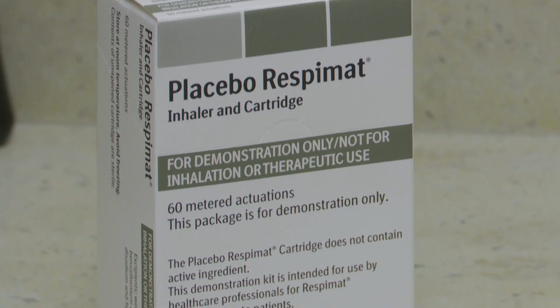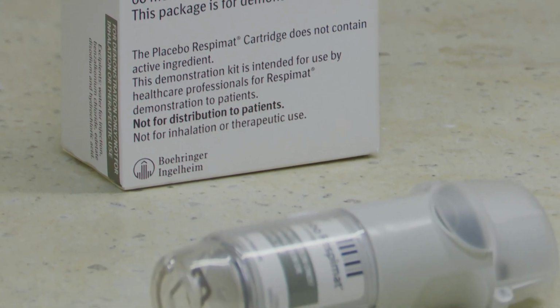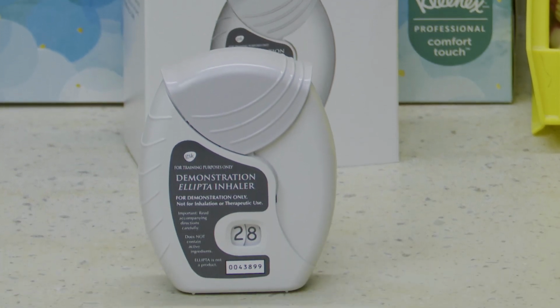The next big mistake Van Klompenburg sees is patients not using the long-term medication frequently. I like to tell my patients with those maintenance medications, you're not taking it to improve your breathing right now or even tomorrow. It actually improves your breathing in 3 or 4 days from now, and that's why we need to stay steady with it.